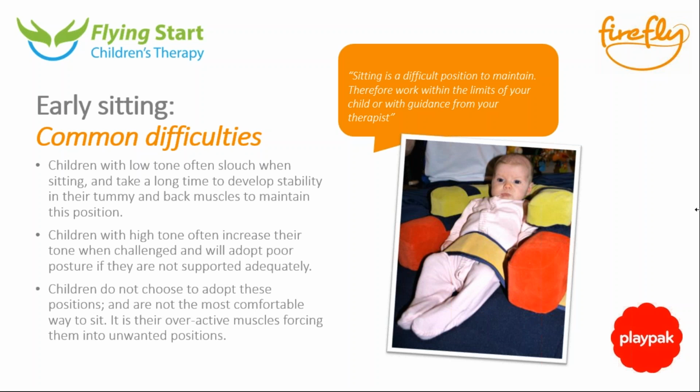The thing about sitting is that it is a much more challenging position than the previous laying positions that we showed in the previous webinar. So because it's difficult, you might want to work within your child's ability and seek guidance from the therapist. However, generally speaking, if a child is well supported, they won't adopt any of the poor postures that they can show through increased or decreased tone. The thing to note is that although the Playpak is very supportive and allows you to do various different sitting activities, it does not replace the supportive seating that would be provided by your occupational therapist if you have one.